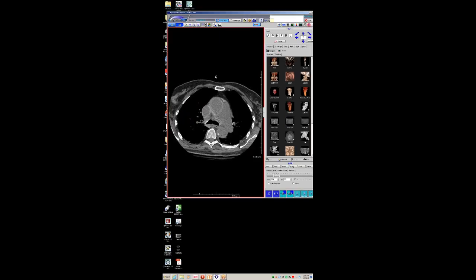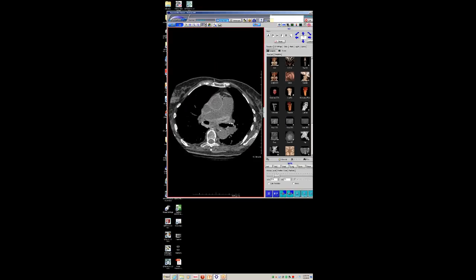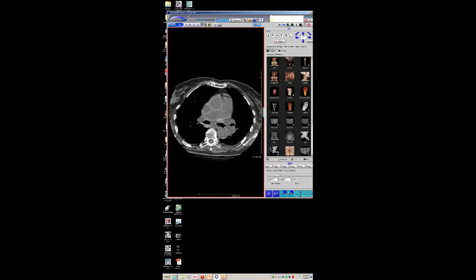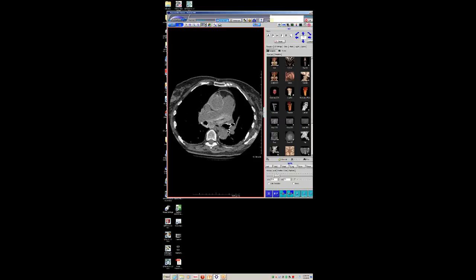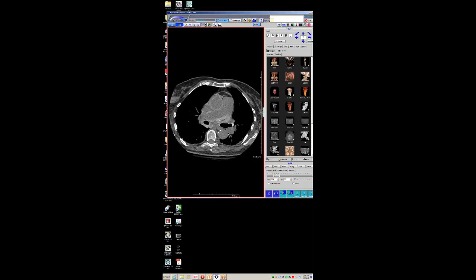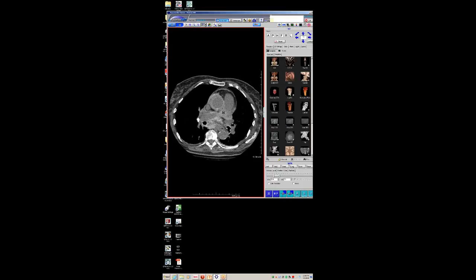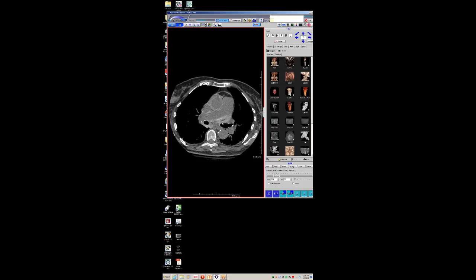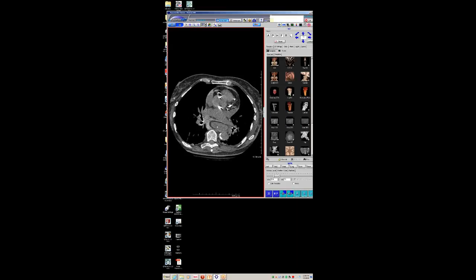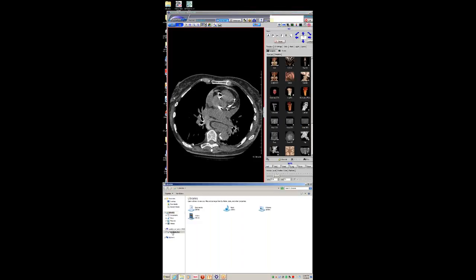This is the non-contrast study on the same patient showing how hyperdense this material is. There is a type A intramural hematoma. There's clearly blood or contrast extending along the shared sheath between the pulmonary arteries. There's blood in the various pericardial recesses — the left pulmonary venous recess, portions of the transverse sinus, portions of the oblique sinus — and even some extending into the mediastinum.